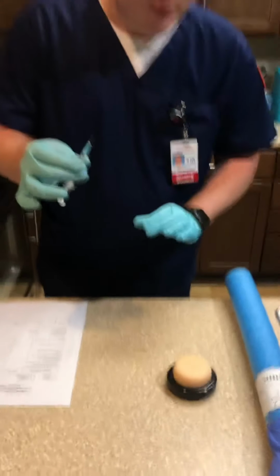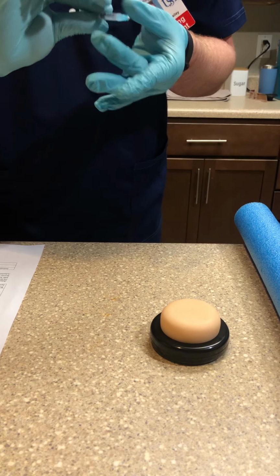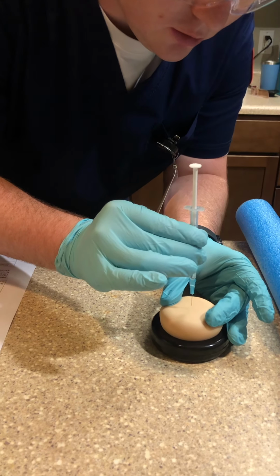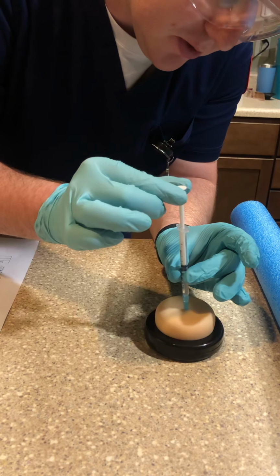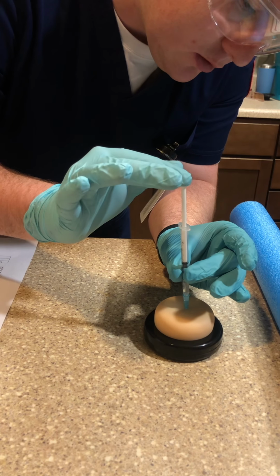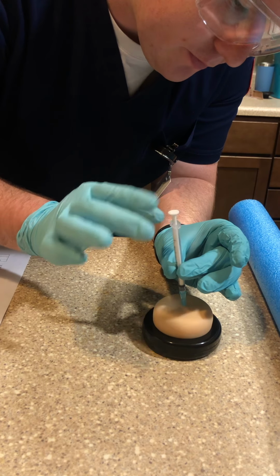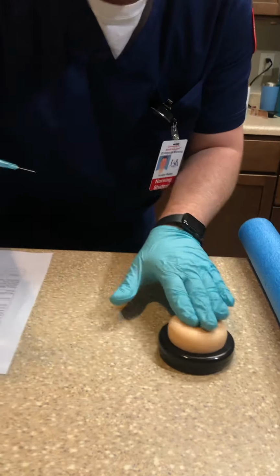Mr. Jones, I'm about to give you your heparin shot, okay? You're just gonna feel a little pinch. So I'm going to go ahead and spread the skin and inject at a 90-degree angle. Little pinch. Okay, gonna aspirate for blood return. I do not see any blood return. I'm gonna inject the medicine slowly. Okay, now I'm going to take it out and apply gentle pressure.